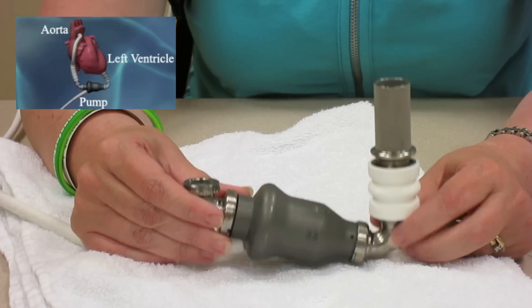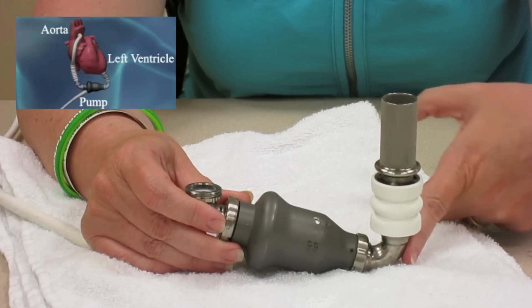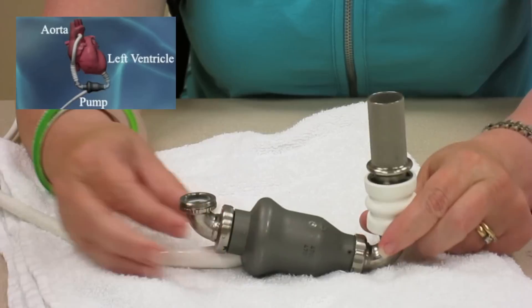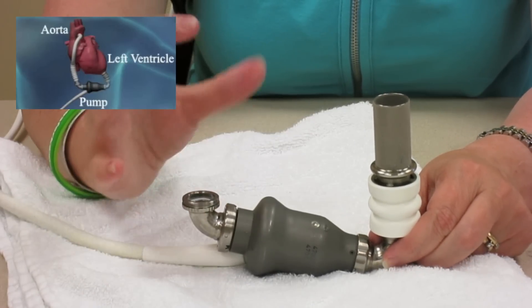This is the part of the pump that is implanted in you. This is sewn into your left ventricle. Blood comes out through the pump, and out here there's another hose attached which is sewn into your aorta.